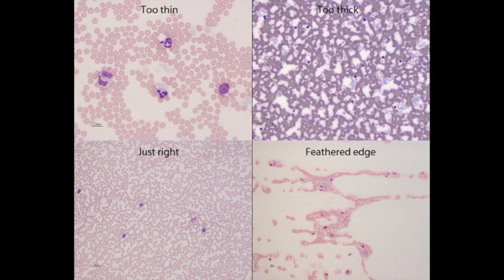This is a microscopic view of what you might see in the fields of view on your slide. In the upper left we see a field of view that is too thin. When it's too thin there's going to be a lot of white space or dead space in between the red blood cells. You typically won't see very many white cells either.